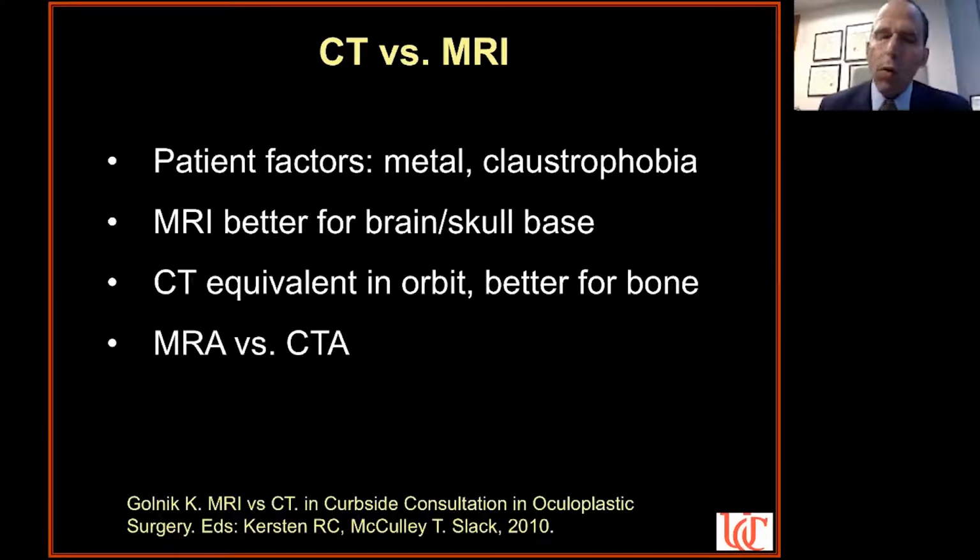If you know where you're getting your neuroimaging, you can often ask which is better for, oftentimes we're thinking about aneurysms, sometimes cavernous sinus fistulas. But if you don't know, you can always ask your radiologist, hey, where we are, which is better for detecting aneurysms? Is it our MRA or is it our CTA? And we'll look at some examples of those momentarily.